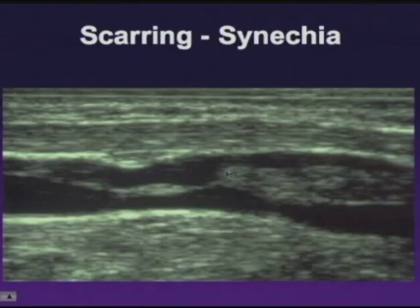Here at the caudal aspect of this material, we see this material on top of the synechia or a thickened synechia. And the two can be differentiated by compressing in real time. If that material is soft and lying on top of the thin white line, then it's likely acute on chronic disease. If, on the other hand, this material is stiff and unchanging, it's just a thick web-like change.